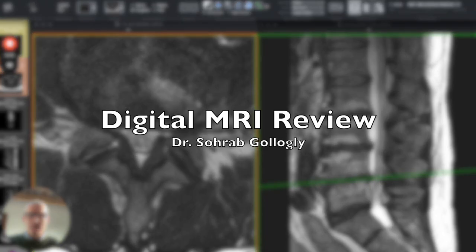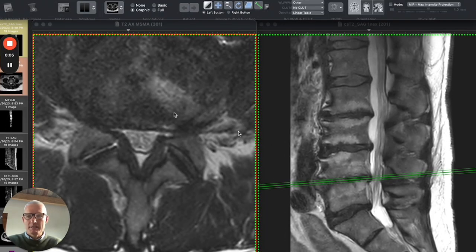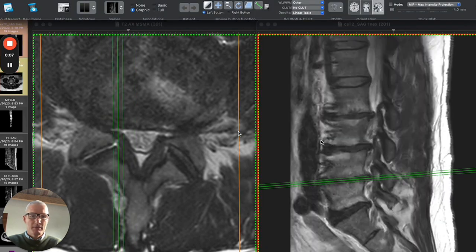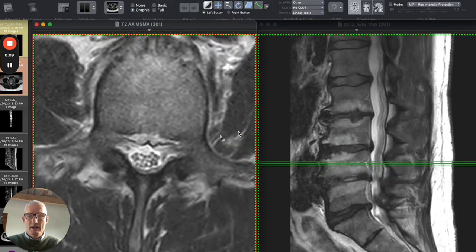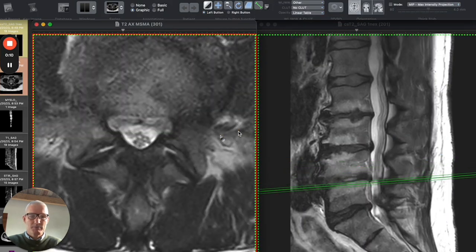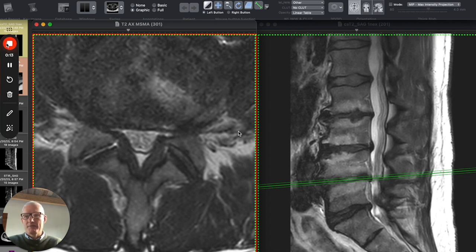Morning, this is Dr. Sohrab Gollogly in Monterey, California. I received the MRI scan that you transferred. Let me walk you through the anatomic findings and then we'll schedule a follow-up call or a Zoom conference.